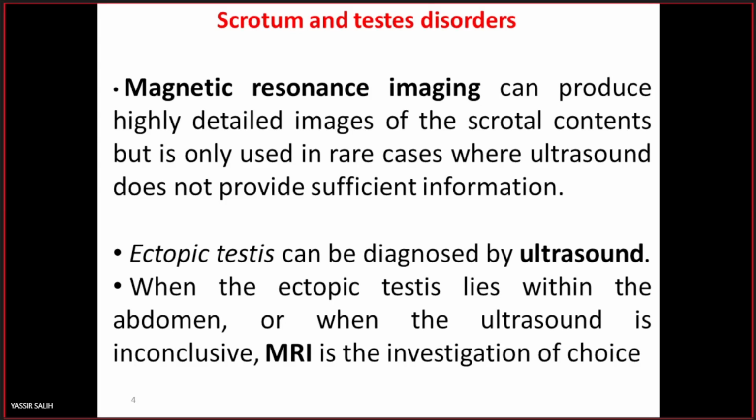But you have to use ultrasound for a patient presenting with scrotal swelling and scrotal pain before MRI. Also, ultrasound can be used for searching for ectopic testis.